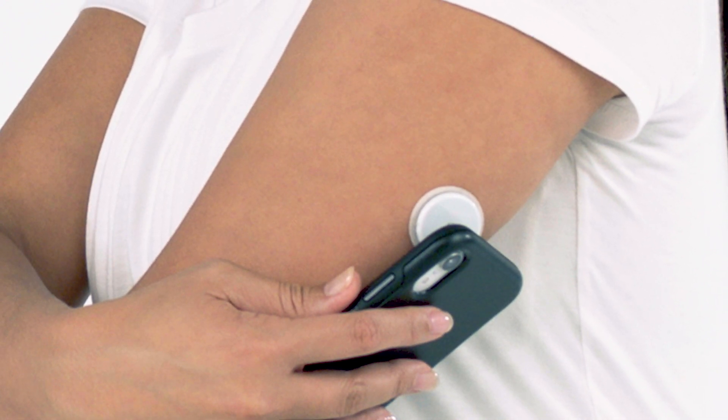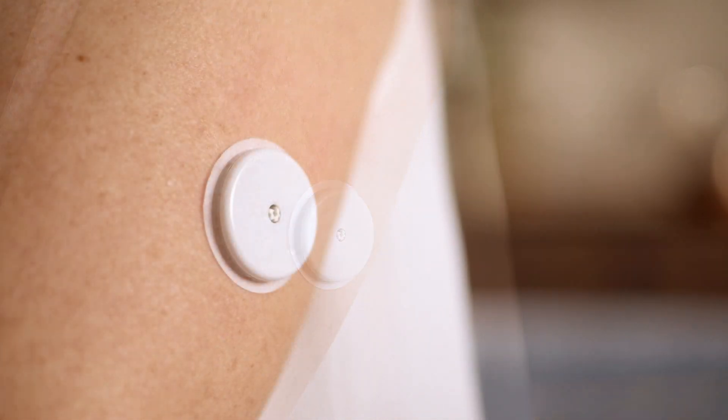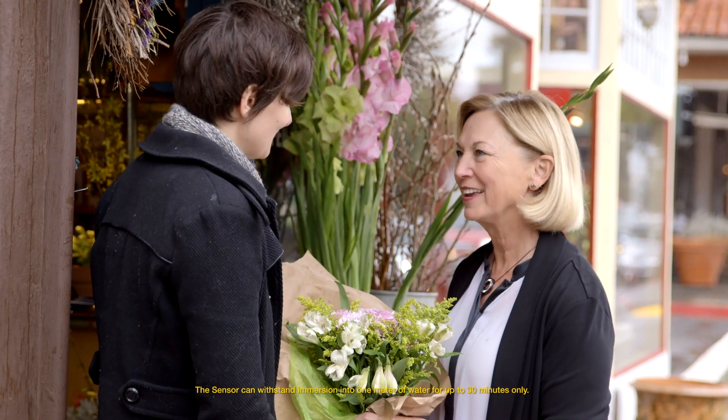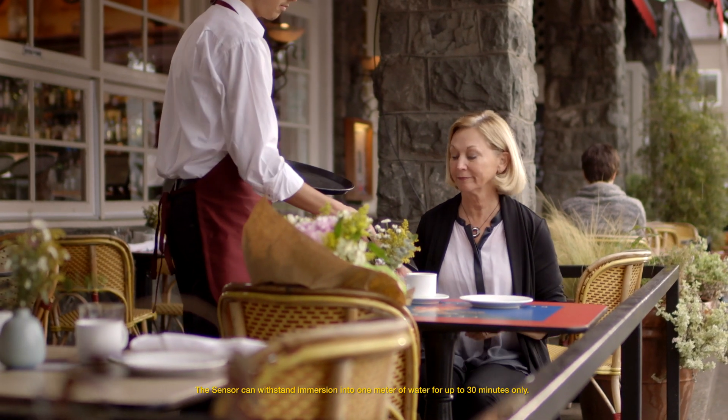Hold your smartphone to the sensor to scan it. You will receive a tone and vibration after you have successfully started the sensor. Sarah can now get her glucose reading in one hour. The sensor is discreet — it's similar to the size of a two pound coin. It's water resistant, so you can swim, shower, or exercise.